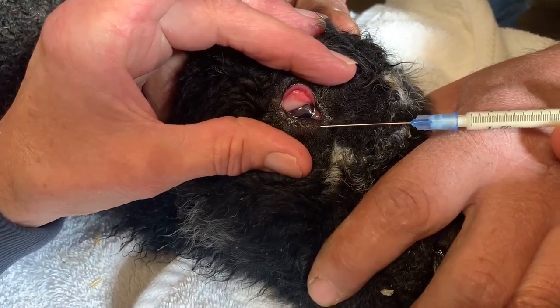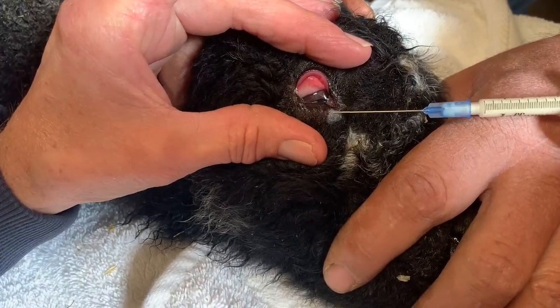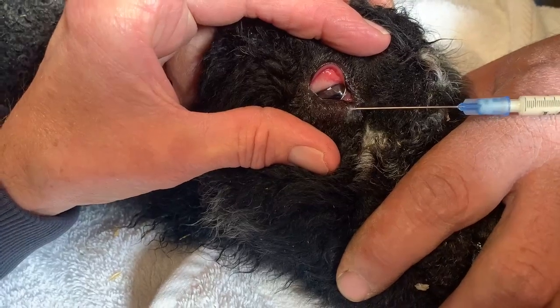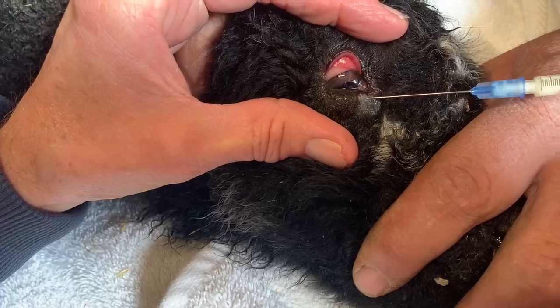I'm going to inject between a half a cc and a cc. It's going to blow the eyelid up like an inner tube, and that will help the eyelid to roll out.